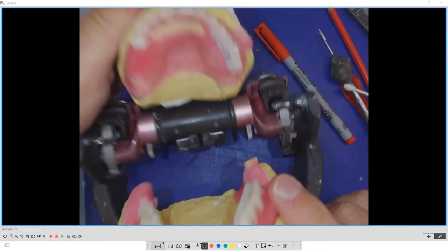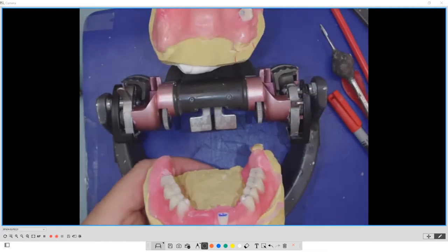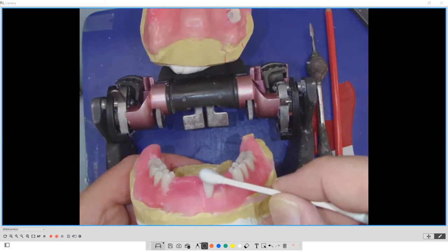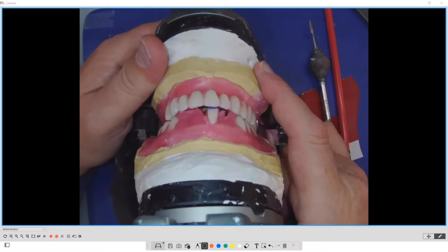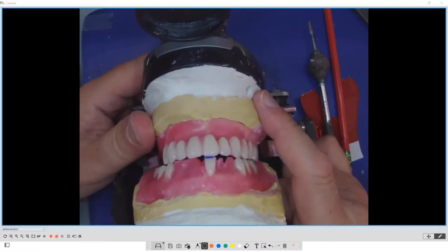Laboratory speaking, I'm gonna check and I'm gonna draw there. So I'm gonna color that. Intraorally, I'm gonna take the Q-tip, color the paper, and then mark it for in the clinic. So intraoral chair side. And then I can reinsert the denture into the patient's mouth. And then I'm gonna get them to talk. Days of the week, months of the year. Remember, they just don't go forward. So we check protrusion forward.